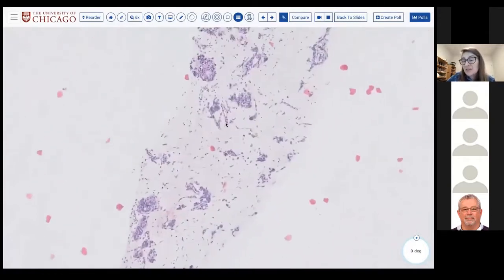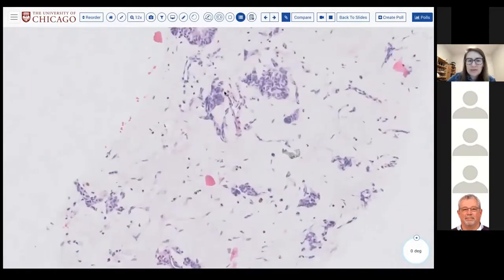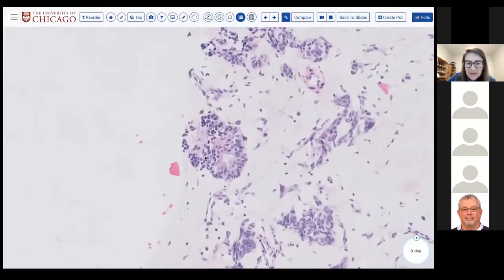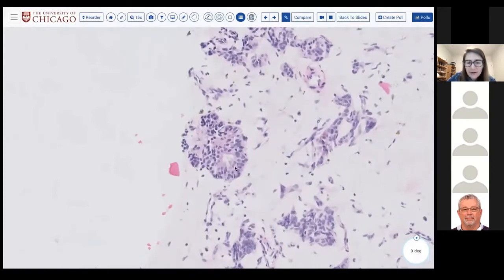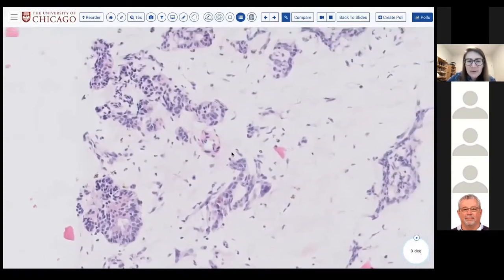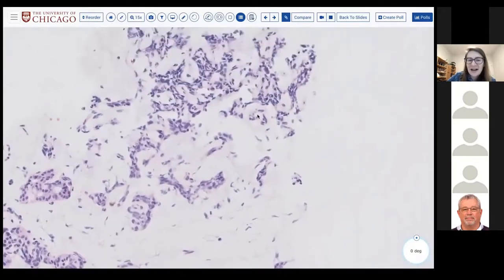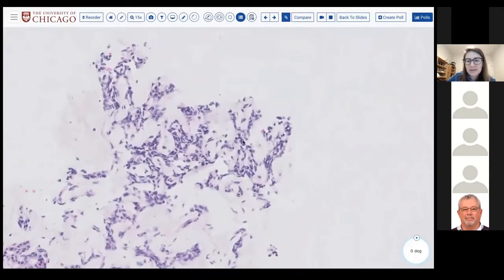Then is it epithelial, myoepithelial, or both? If you look carefully, you may start to see some duct-like structures with some pale pink eosinophilic epithelial cells, perhaps with a more peripheral layer of bluer cells. So you get perhaps a vague suggestion that there may be some ducts in here. However, the background is mostly these corded, arguably myoepithelial cells.